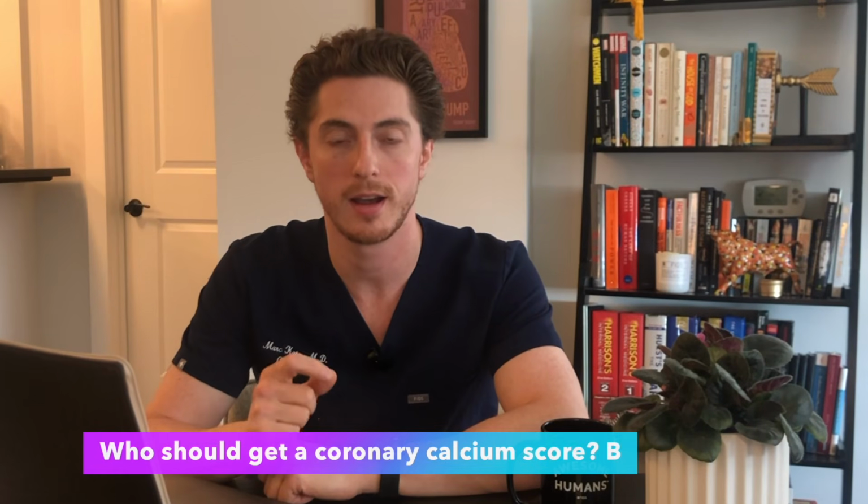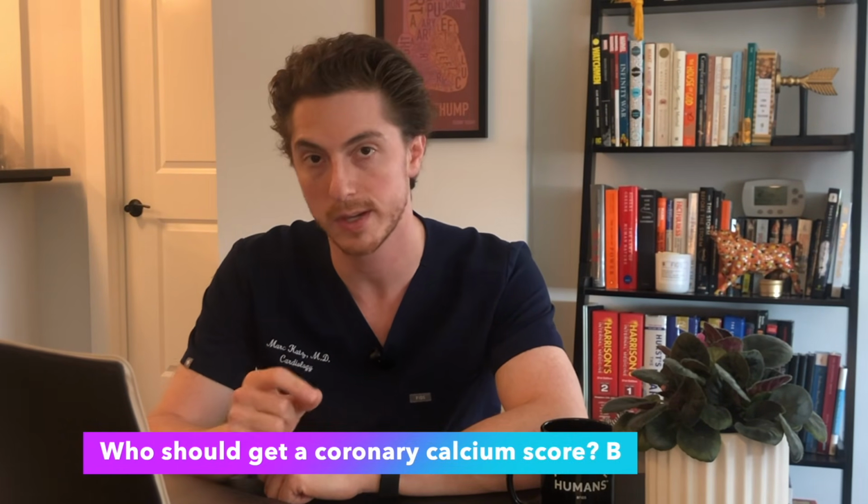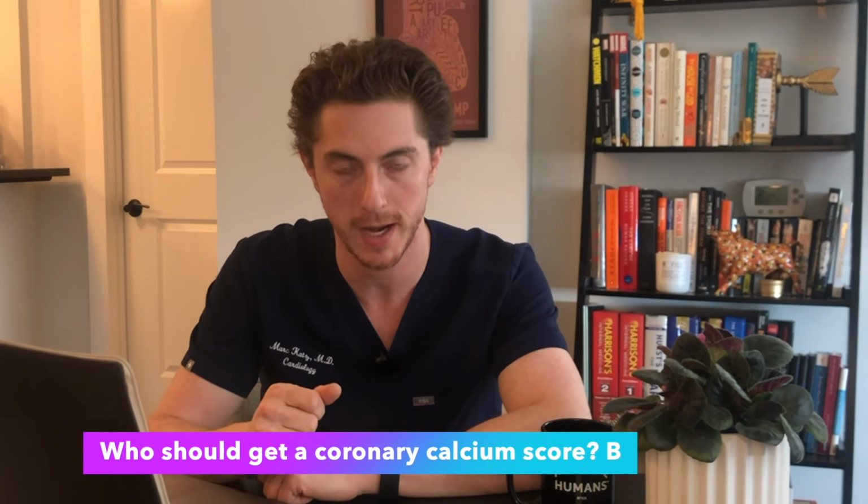Earlier, I mentioned that not everyone should be getting this test. And the reason for that is that it was studied in a specific patient population. You always have to know, what am I going to do with this test when I get the results? A coronary artery calcium score was studied in patients 40 to 75 years old.